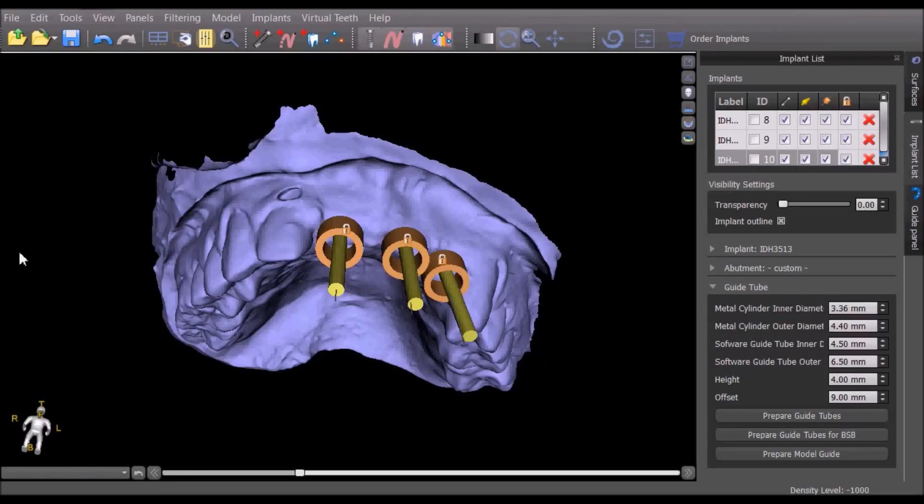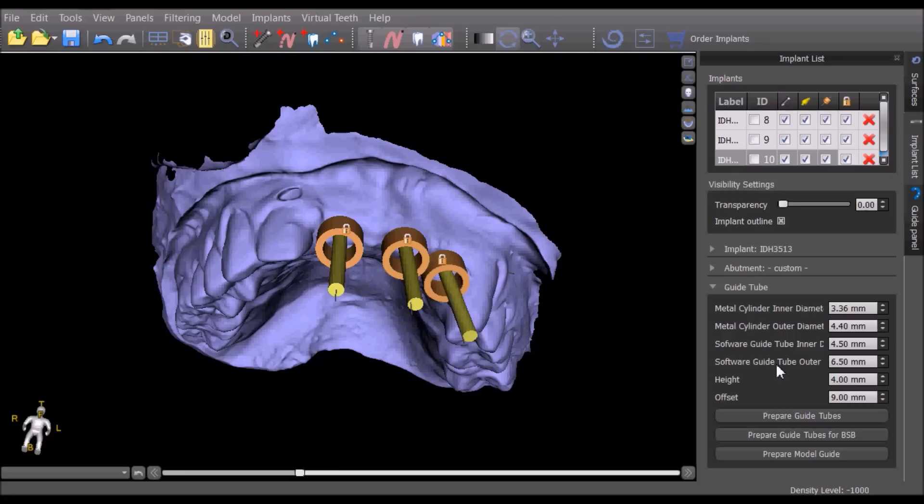The software automatically sets the diameter values for the metal cylinders and software guide tubes to work with BlueSkyBio's direct cut guided surgical solution. The values can manually be changed to prepare a surgical guide to work with other guided surgical kits.